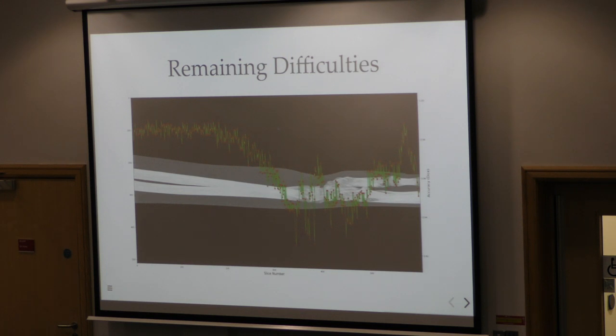And what this image illustrates, with the green line, is our accuracy for the segmentation along that particular slice. So along where the bone is, or where the thick bones in the arm are, you can see that the accuracy sits somewhere around 99%, which is the right-hand y-axis in terms of whatever accuracy score we've used here. And then when you get closer to the joints in the bones, you start to lose that level of accuracy. So our task now is to take the work that we've done and hopefully get it to the point where we have a straight green line across the top. And that would be a model that was, I guess, nearly at the point where we don't need human interaction anymore.